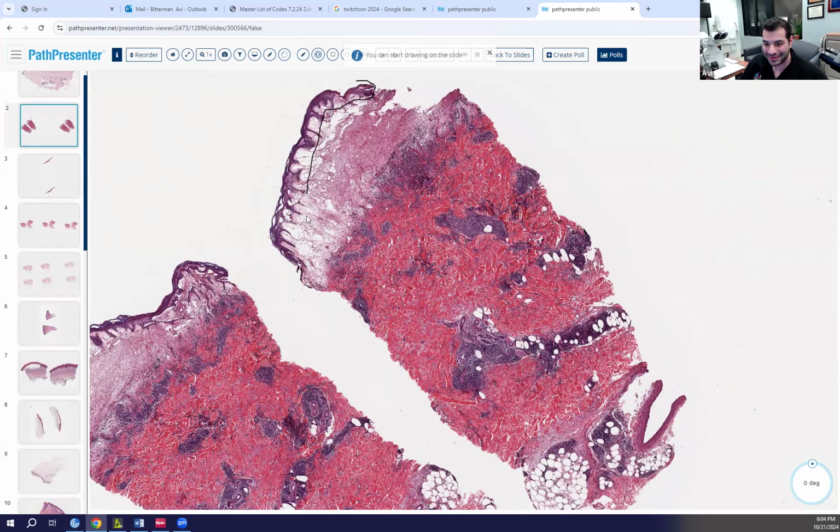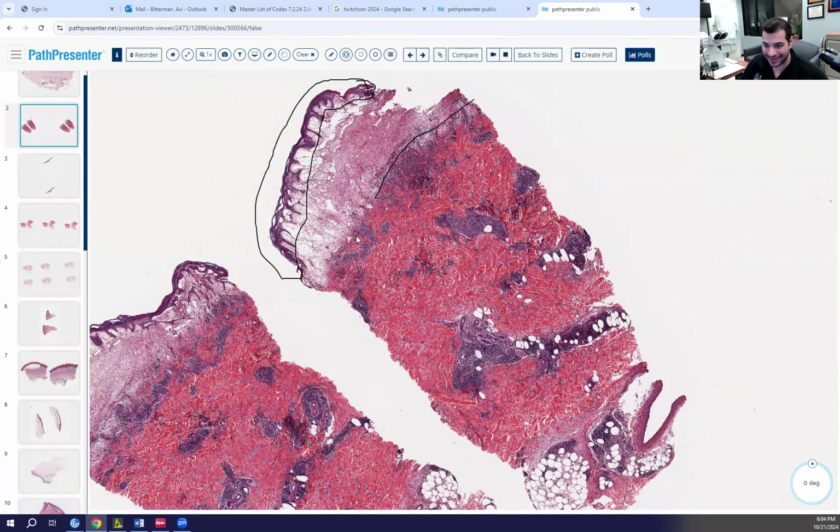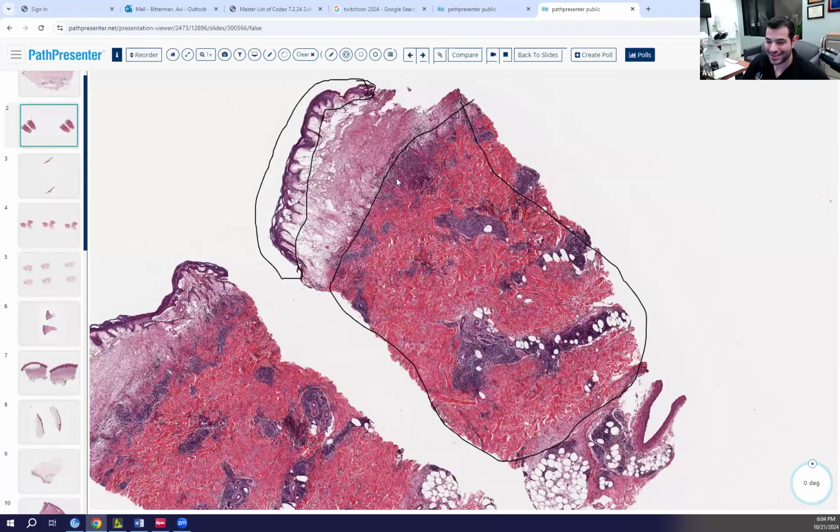It's here, right? And where's your dermis? It's here. So is this a wheal? I guess it's more like a blister. There's a clear split, this thing came off. It's gone.